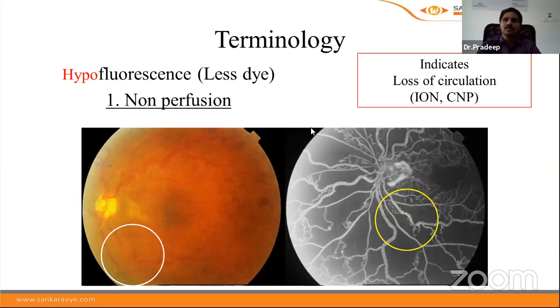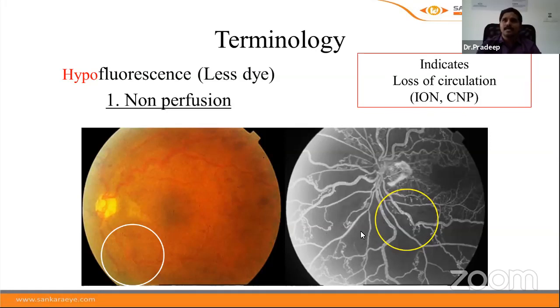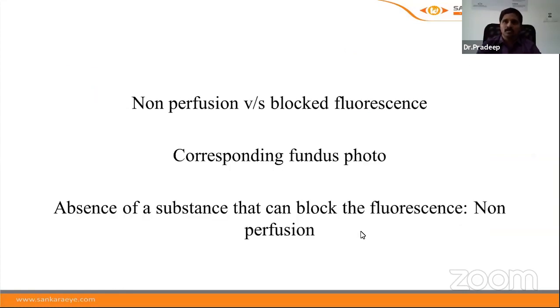Non-perfusion, or vascular filling defect, is hypofluorescence due to less dye in the tissue. There are extensive areas of hypofluorescence with no corresponding structure on fundus photo to obscure fluorescence — it is due to decreased dye concentration from loss of circulation, absence of capillaries, or complete capillary occlusion. To differentiate non-perfusion from block fluorescence: in non-perfusion, the color photo shows no blocking substance, whereas in block fluorescence a specific structure responsible for the block is visible.